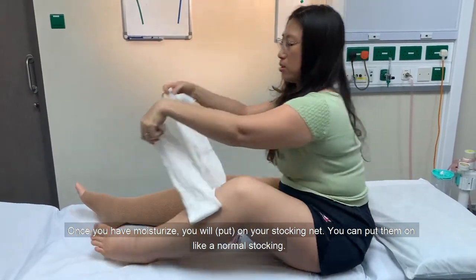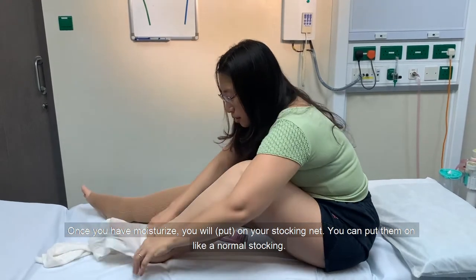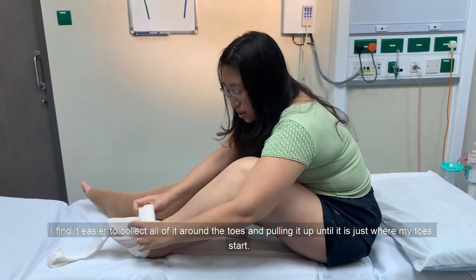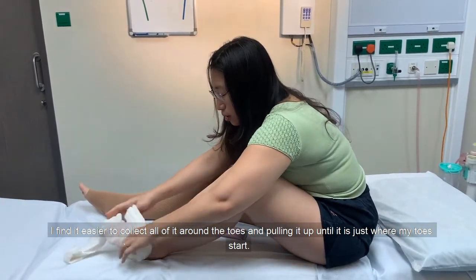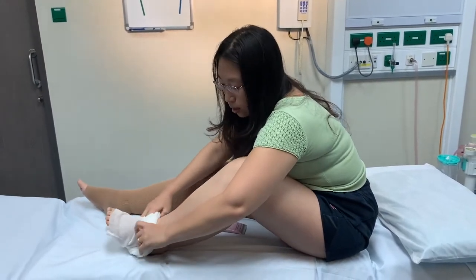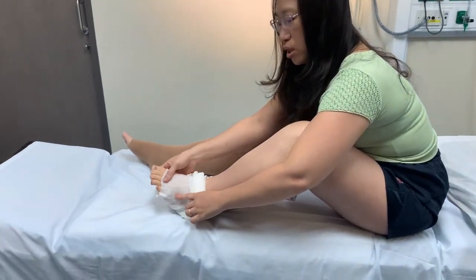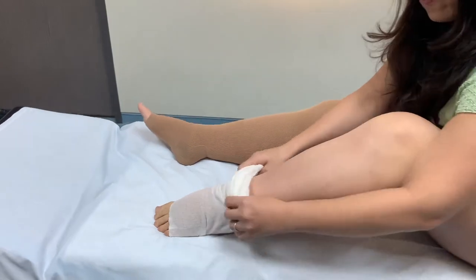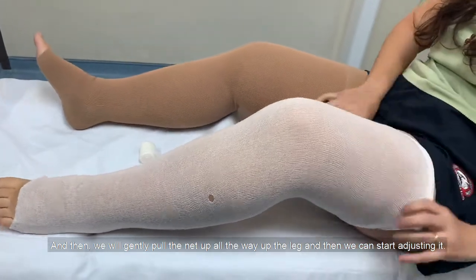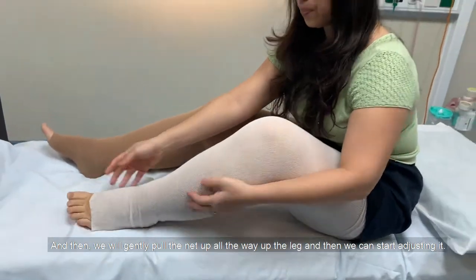Once you have moisturised, you will pull on your stocking net. You can put them on like a normal stocking. I find it easier to gather all of it around the toes and pulling it up until it is just where my toes start. Then gently pull the net all the way up the leg and start adjusting it.